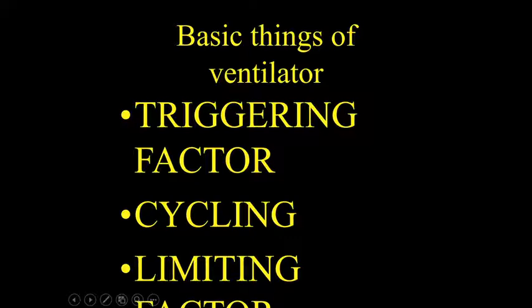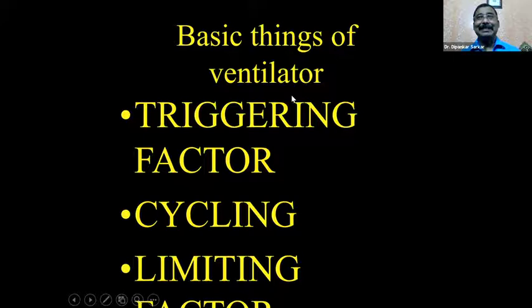For every action, if you go through the playing of chess, it has an opening game, middle game, and end game. Like that, a ventilator should have three factors. One is the triggering factor, one is cycling, and one is the limiting factor.